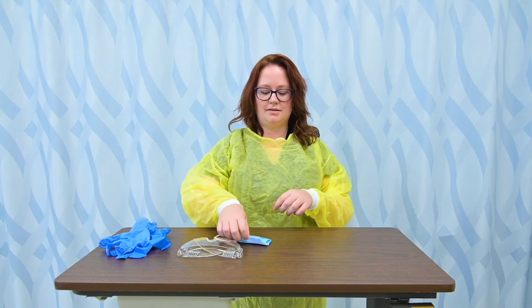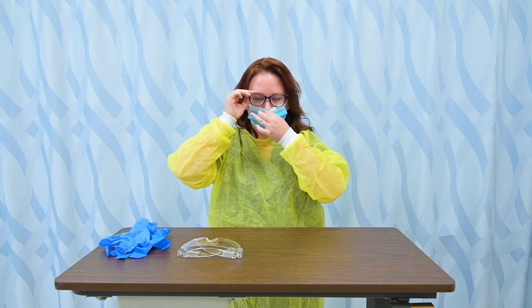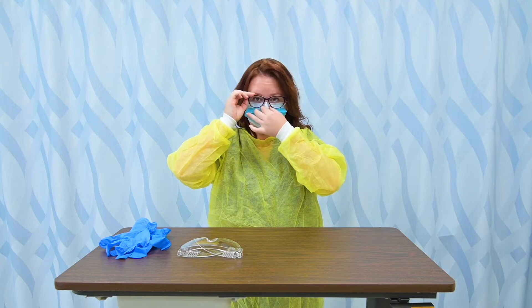Next is my mask. I'm going to go ahead and put my mask on. The blue side goes out if we're using these medical masks, and there's a metal piece in the nose to bend it over. I always want to make sure I pull it down to cover my chin.